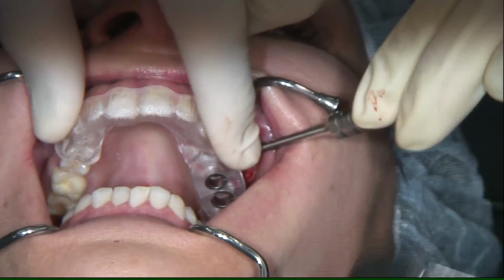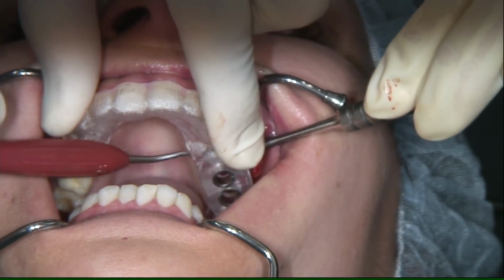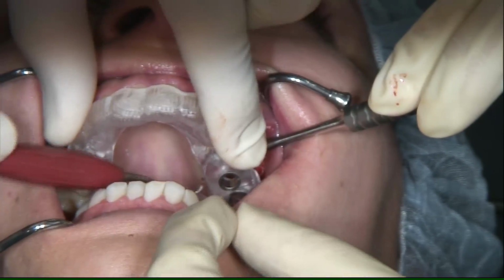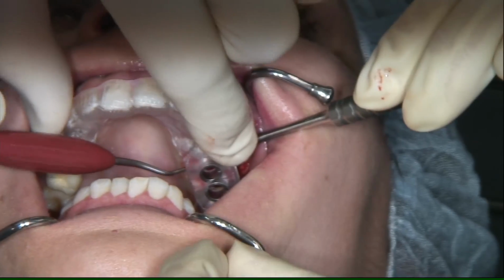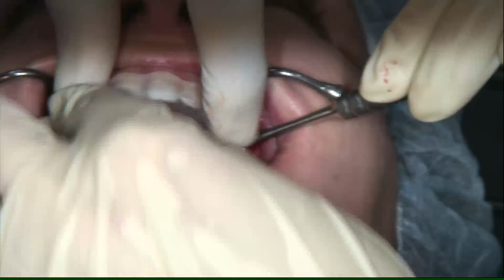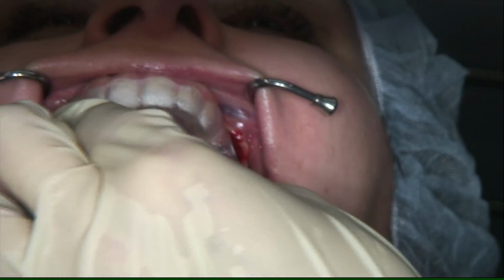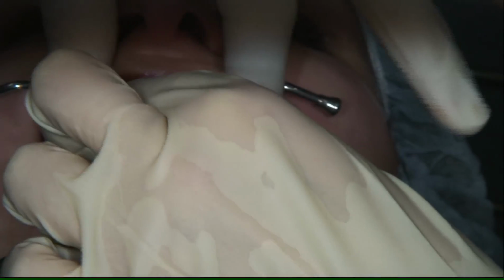The OptiGuide is in comparison to the classic guide. Let's say that the data are collected completely digitally. So the OptiGuide drilling template was chosen and manufactured entirely from the digital data collected before.